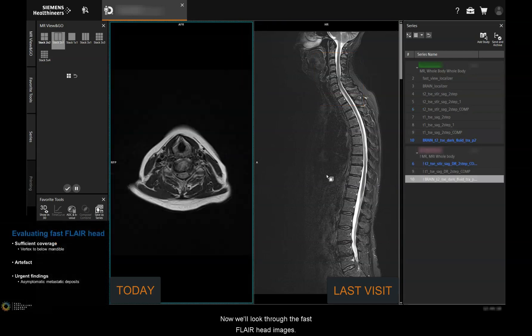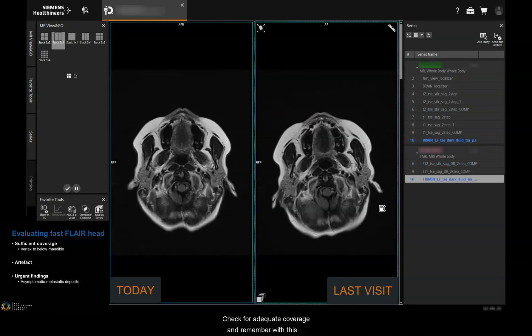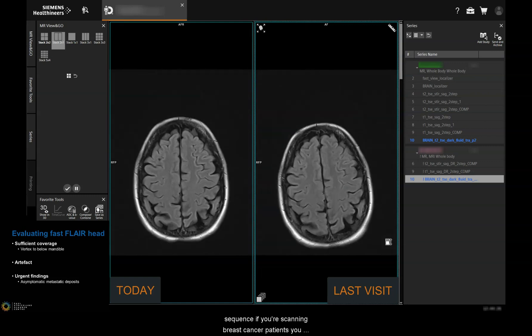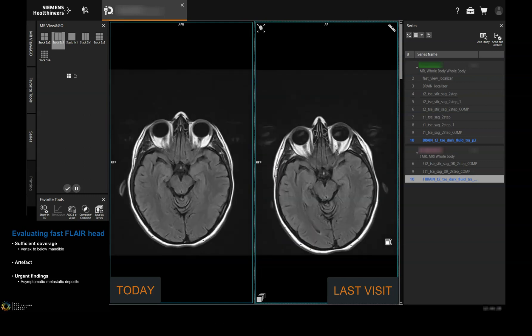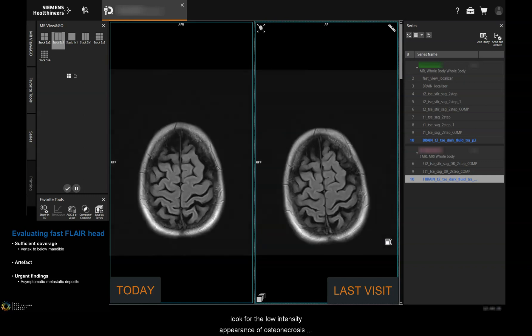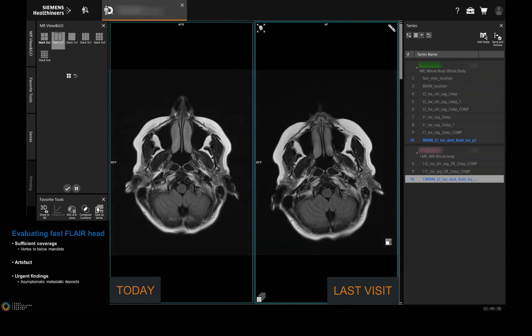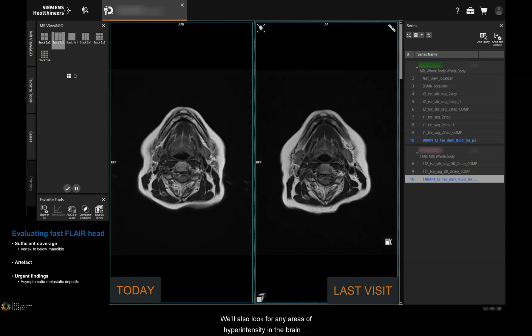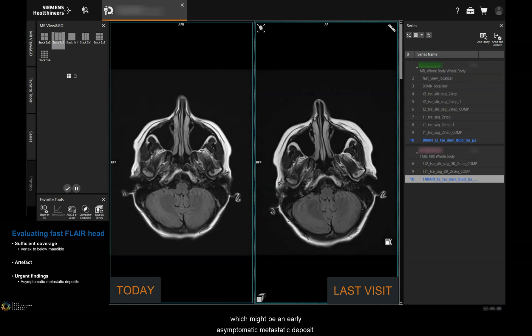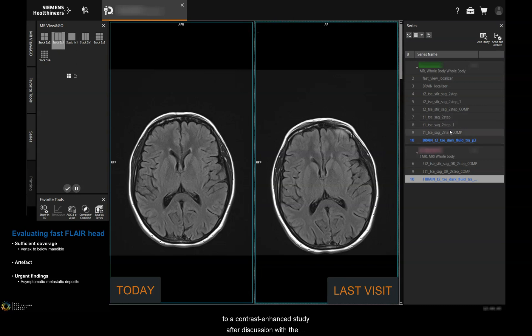Now we'll look through the fast FLAIR head images and check for adequate coverage. Remember, if you're scanning breast cancer patients, you need to include the whole mandible. The sequence is run without a fat suppression pulse to look for the low intensity appearance of osteonecrosis of the mandible versus the normal bone marrow. We'll also look for any areas of hyperintensity in the brain, which might be an early asymptomatic metastatic deposit — if picked up early, you might be able to proceed to a contrast enhanced study after discussion with the reporting clinician.